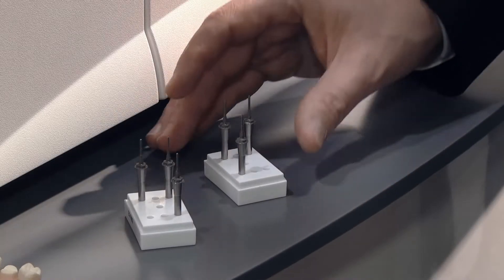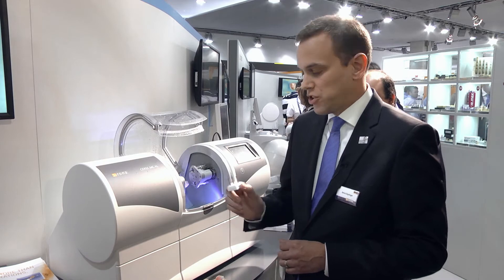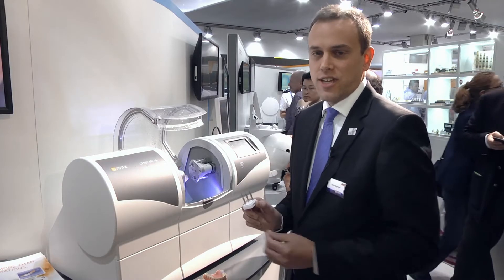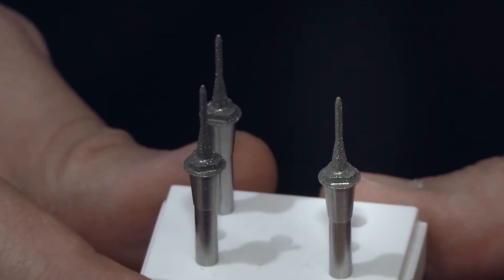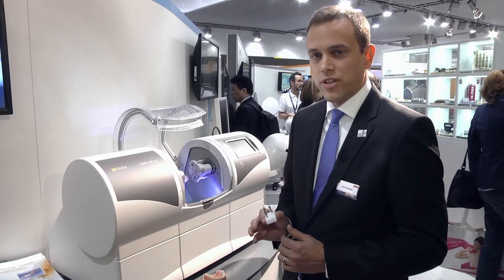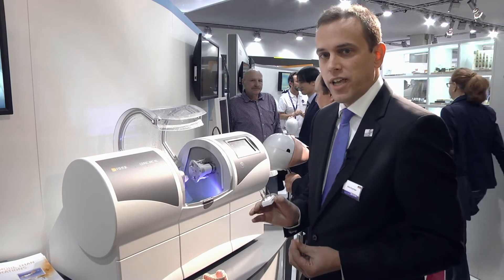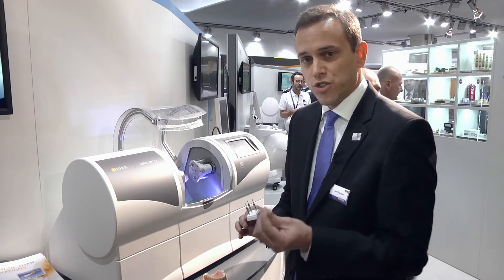Then, in a second step, we've also developed a cylinder-pointed Burr 12EF, which has been specifically developed to provide the highest aesthetic details for fissures. And because of its finer angulation, which is approximately 30 degrees, as compared to the 45-degree angulation of the cylinder-pointed Burr 12S, it's able to really go in and remove material much deeper and provide finer fissure details.